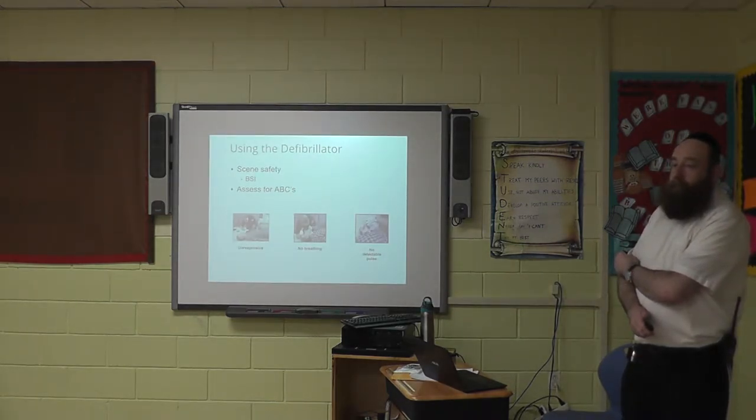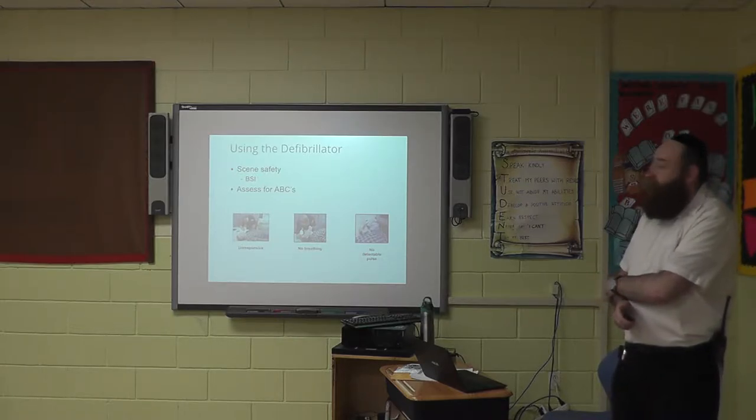There are no extra pads for the AED. There are. Yeah, they're just expensive. The mini electrodes are not expensive. I sell them. You're not paying for it.